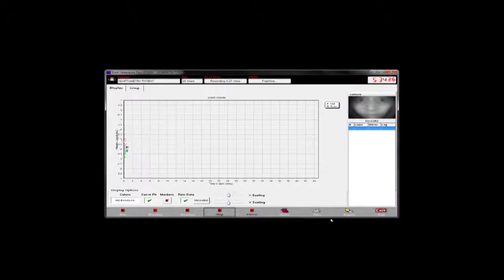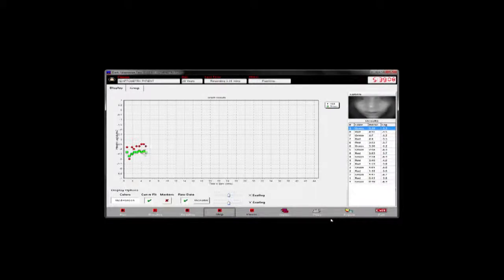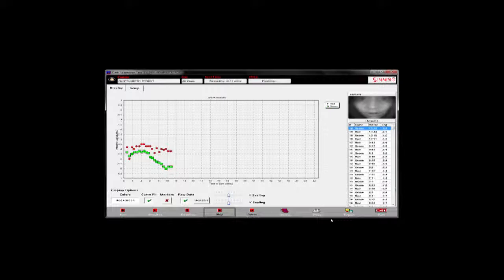We can demonstrate this effect using red and green flashes. The response to red flashes, which are not visible to rods, follows the cone sensitivity curve, while green flashes, which are visible to rods, follow the rod adaptation curve.